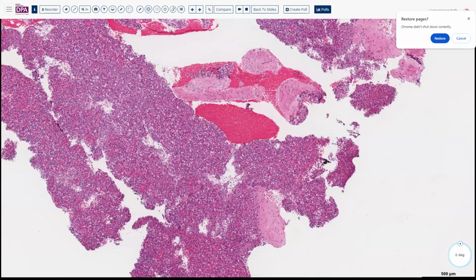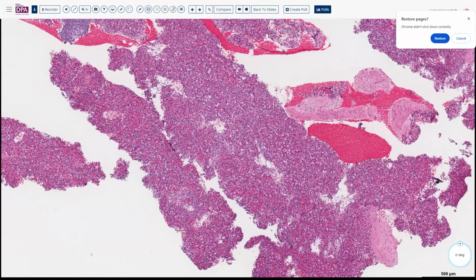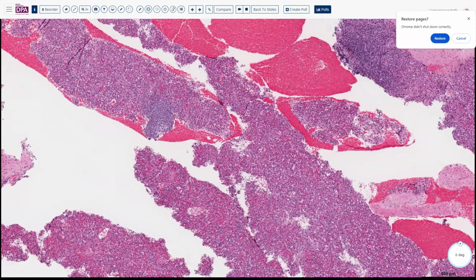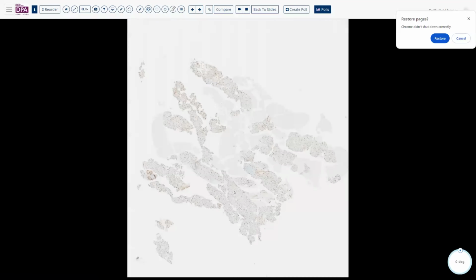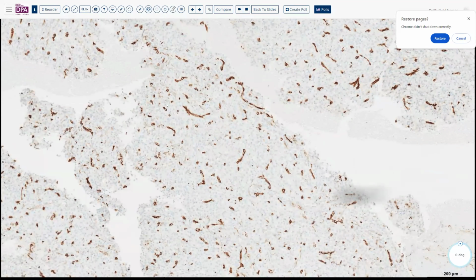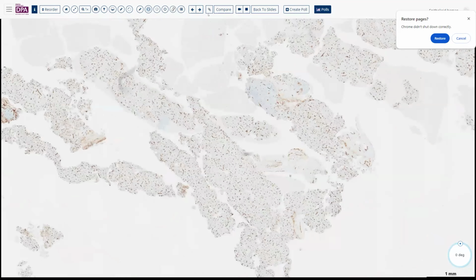So I began to think about various angiomatous lesions that can occur in the liver, hemangioendothelioma or epithelioid hemangioendothelioma came to mind. And so we did some further testing. And indeed, here, as you can see with the CD31 stain, we do have quite a lot of staining, quite a lot of small vessels. It's not staining much of the cytoplasm, but there's clearly an abnormal vasculature component to this lesion. That's not the usual pattern for that.